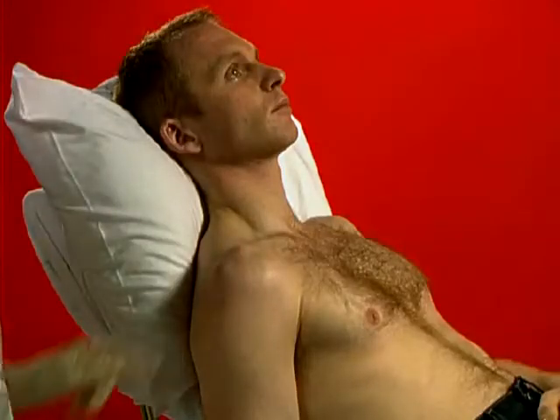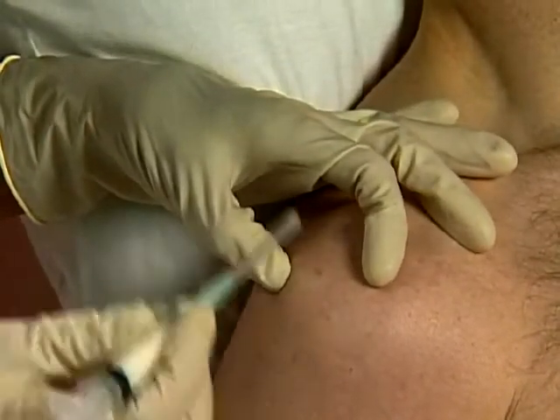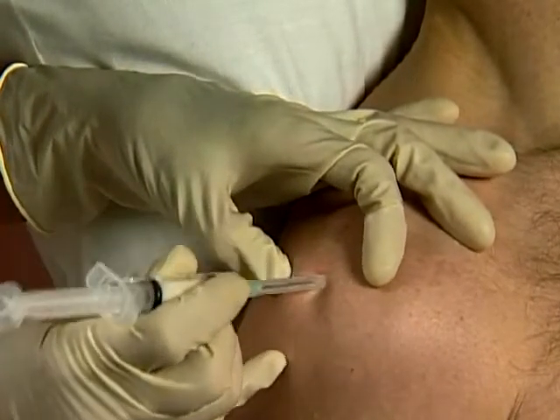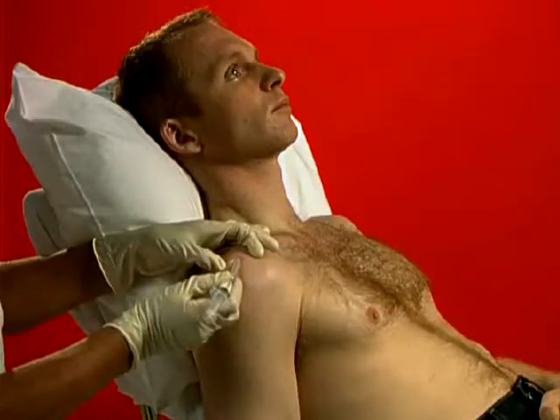Locate the midpoint of the lateral edge of the acromion. Mark entry point, clean and firmly stretch skin and rapidly insert needle perpendicularly. Angle slightly upwards and medially to slide slowly underneath the acromion. Aspirate and inject as a bolus while slowly withdrawing.